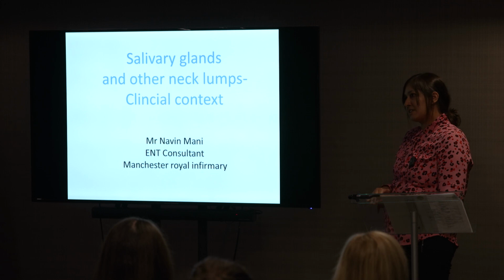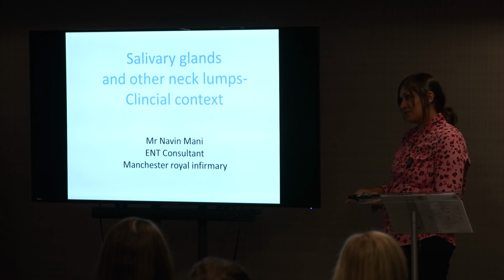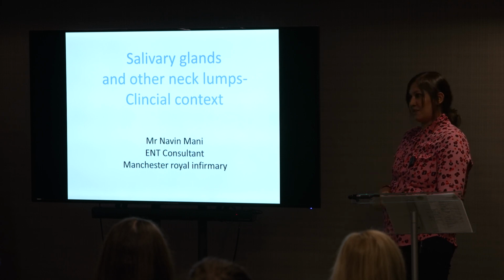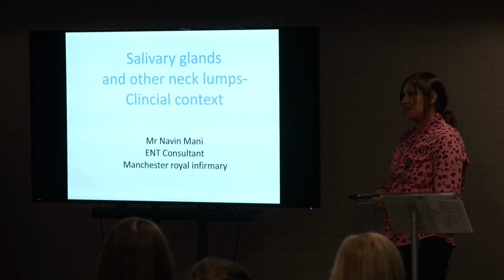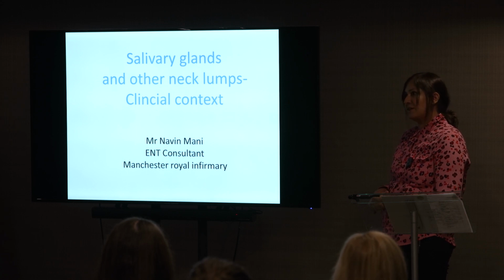If the patient had no comorbidities, wasn't on any blood thinners, and was clinically well, I would do a core. And obviously I would consent them, get their consent and things like that. And if they were happy to go ahead with that, I would go ahead and do it. But it depends on a lot of factors. But I think for lymphoma, for all the immunophenotyping and all the markers that they need, histological diagnosis is key.